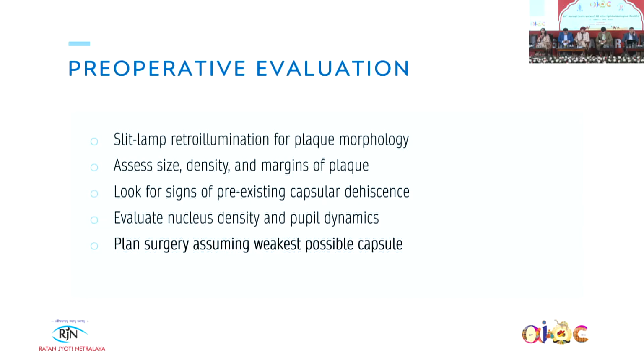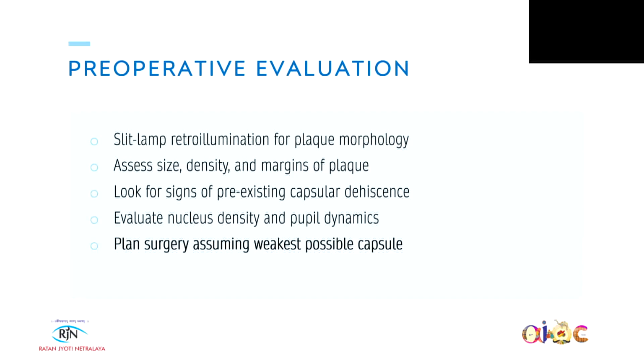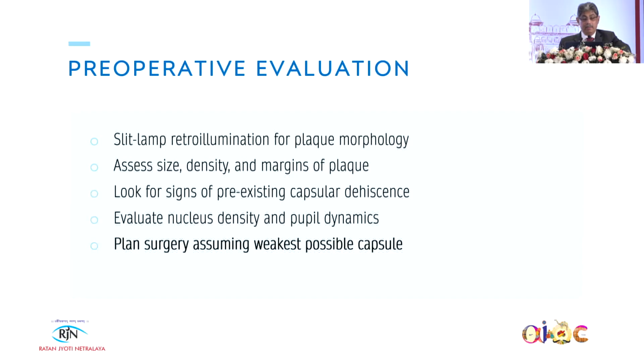We should plan all these cases, as you saw that in up to 35% you get a PC rent, but we should assume that all these cases have a weak posterior capsule, so we should presume this and perform the surgery accordingly.